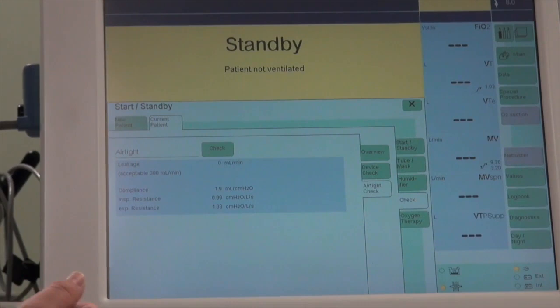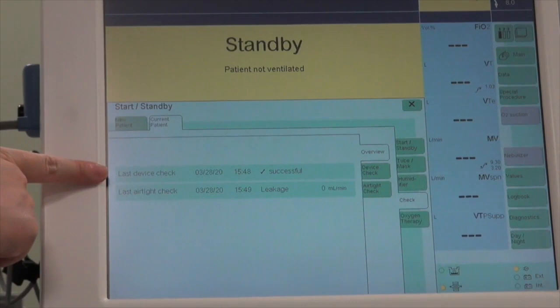After both tests have been done, you can go to Overview. It will tell you the last device check was done at today's date and time, that it was successful, and that there is zero leakage.